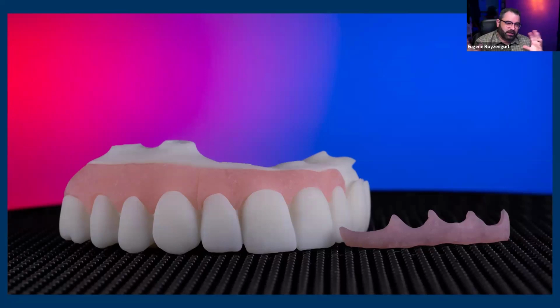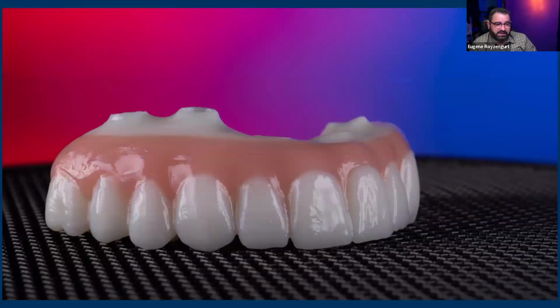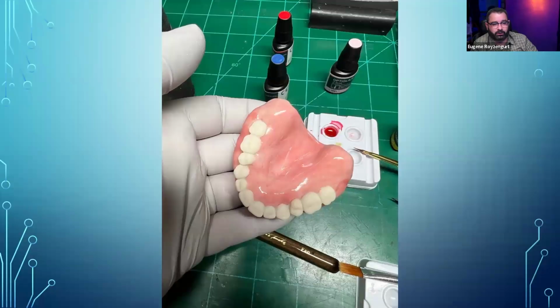I tried some trial and error, and I found out that if I cut the gingival portion into 3 pieces, it lines up a lot better. I basically just bonded it with the same resin, the denture base resin, and glazed the whole thing over the top, and it worked out well.